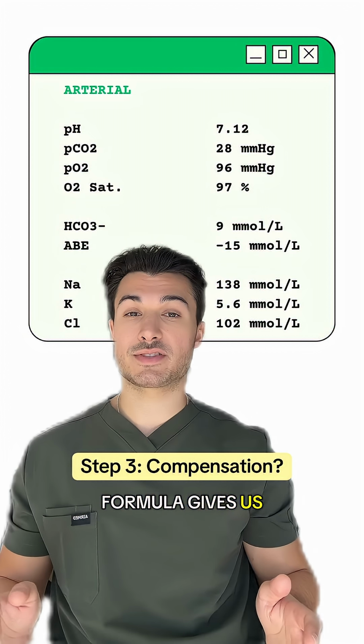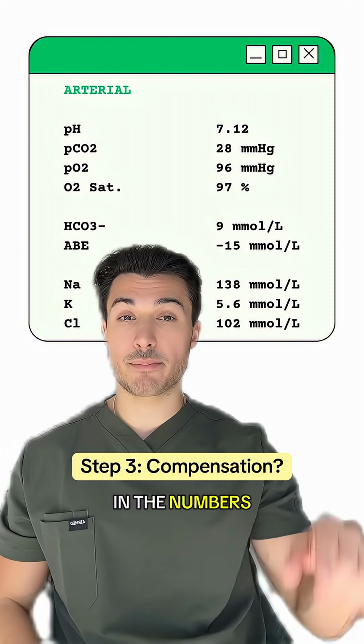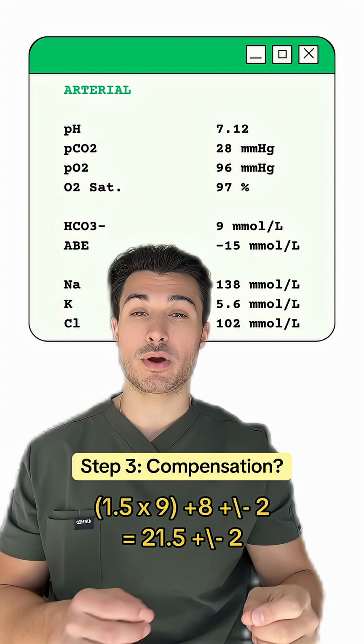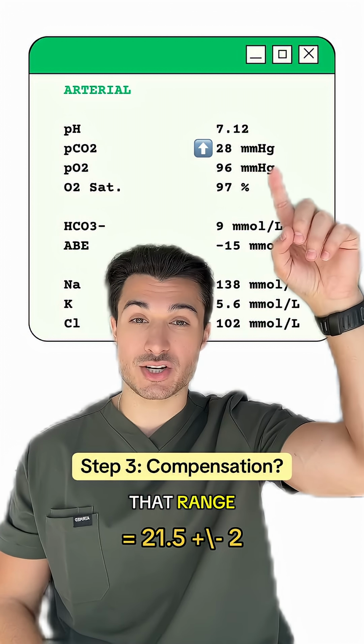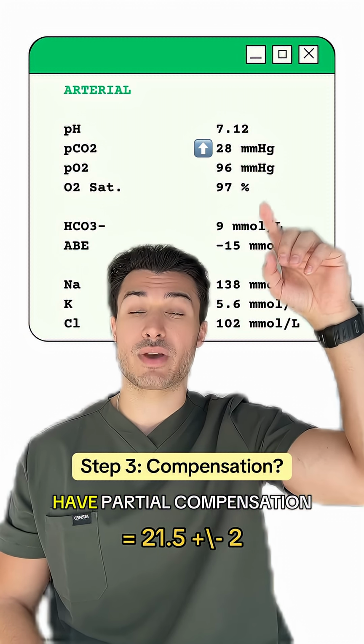Now, what this formula gives us is an expected PCO2 if there's adequate compensation. So if we plug in the numbers, 1.5 times our bicarb 9 plus 8 plus or minus 2, we get 21.5 plus or minus 2. We can look here at our PCO2 and see that it's out of that range, so we don't have full compensation, but this PCO2 is not super high, so I'd say we have partial compensation.